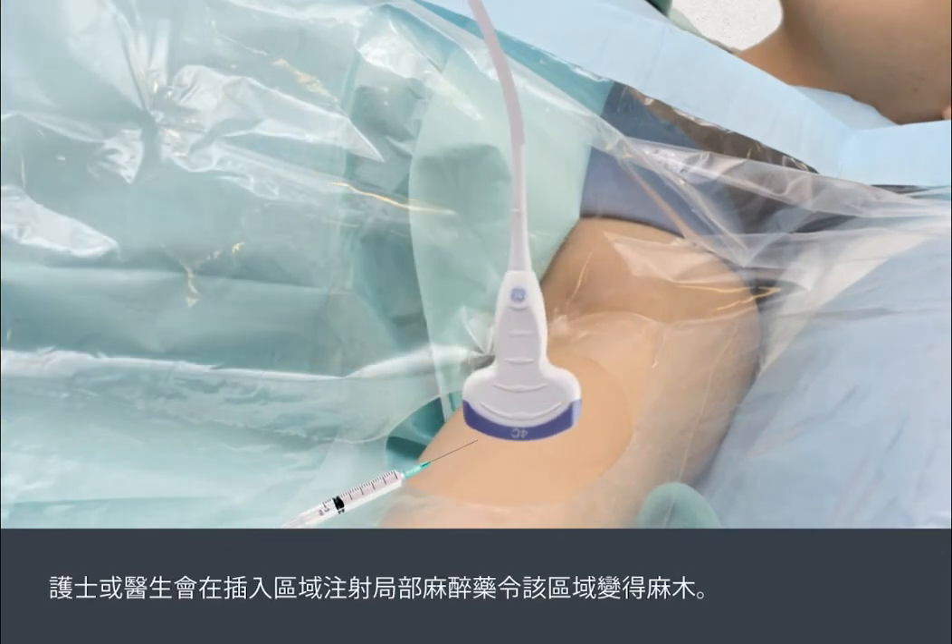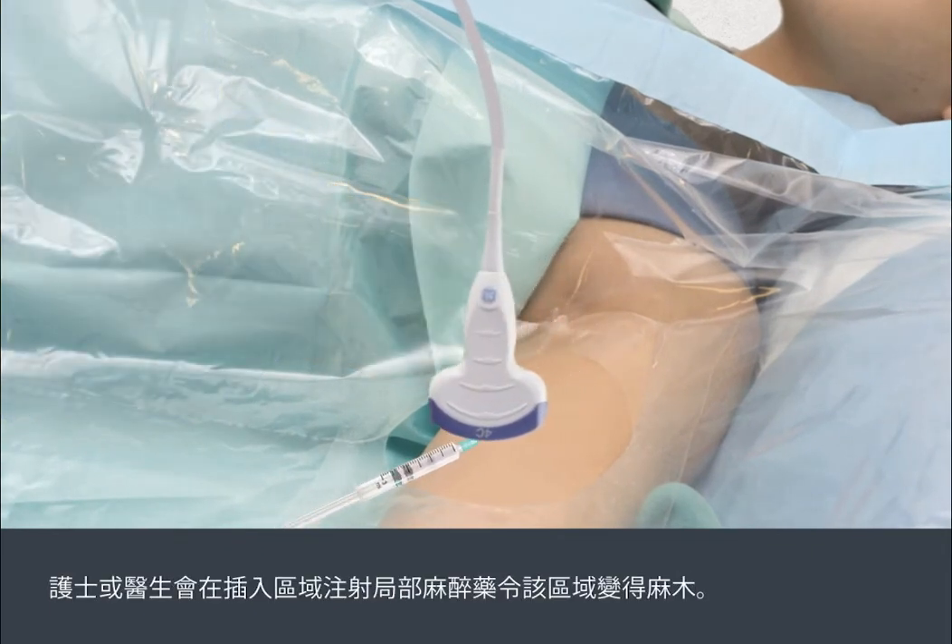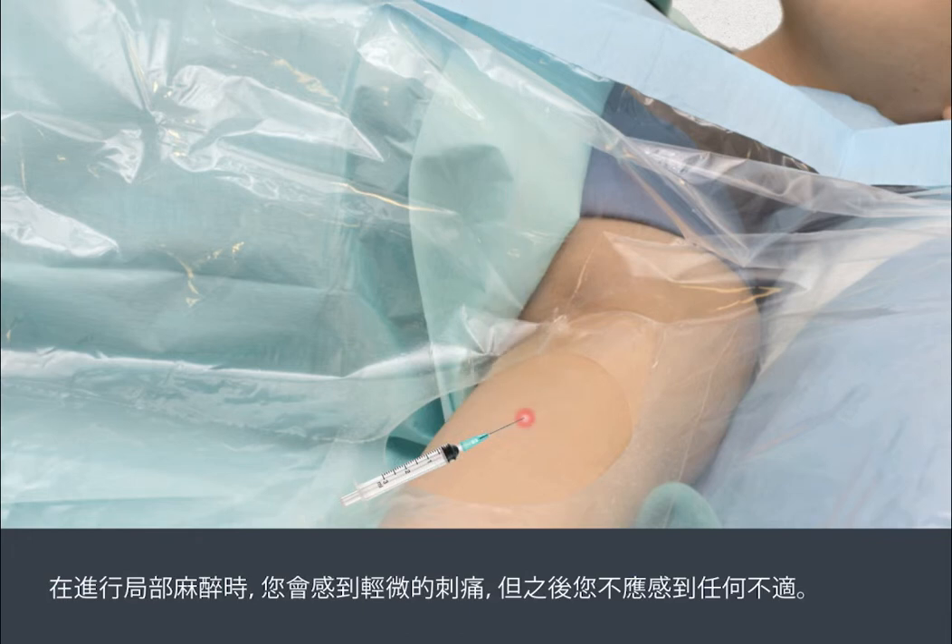The nurse or doctor will inject a local anaesthetic to numb the area. You'll feel a slight sting when the local anaesthetic is applied, but after this you shouldn't feel any discomfort.